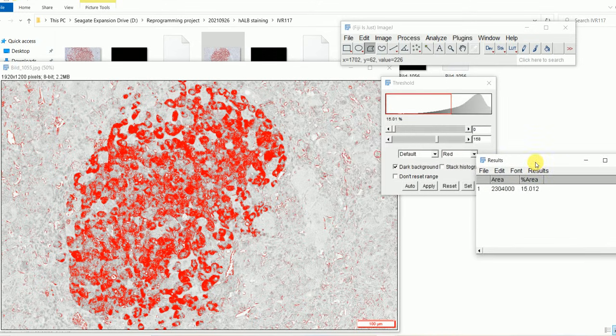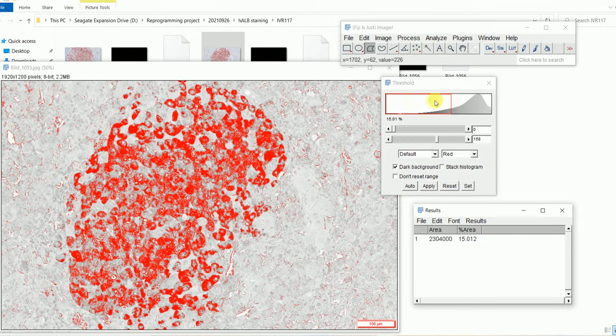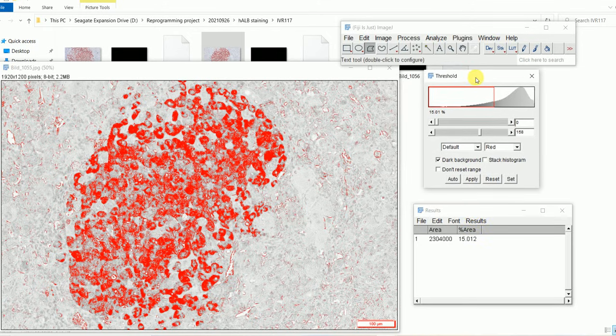But there are a few more things that I want to say. For example, in our original image, this area was not positive. And when you are making the quantification, you may see that areas other than your desired area, which is the positive area, also become red, and this redness will also impact the area that you see here. Then you have to get rid of that, right? So you have to get rid of that background.